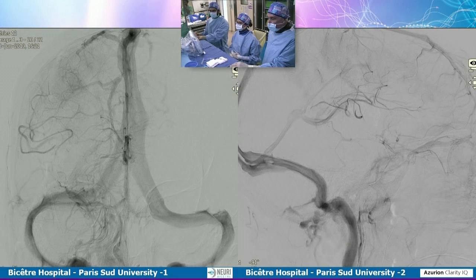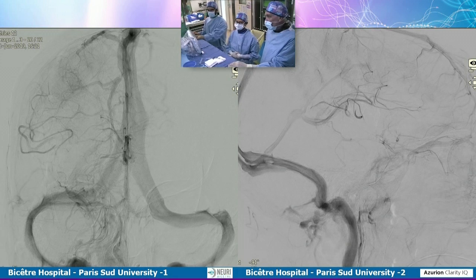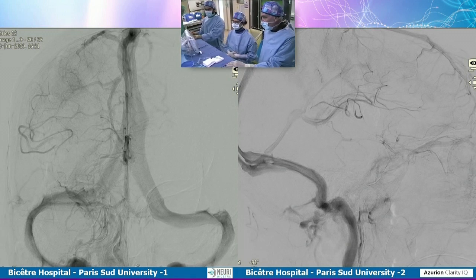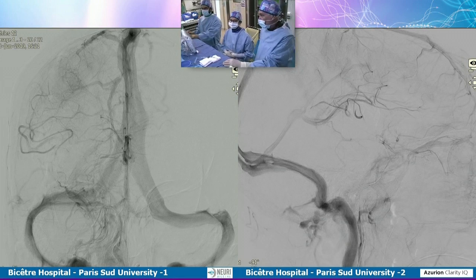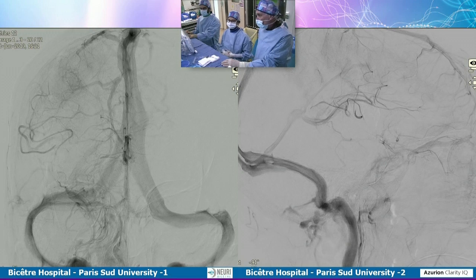Nevertheless, in order to give the chance to this aneurysm to be treated as soon as possible, due to the fact that it's an indirect flow diversion for that aneurysm, we have decided to put a coil in the sac of the aneurysm to induce a better and faster thrombosis of the sac. So the first thing that we are going to show you is we put a coil without any protection of the neck, trying to avoid the bulging of the coils in the origin of the branch.